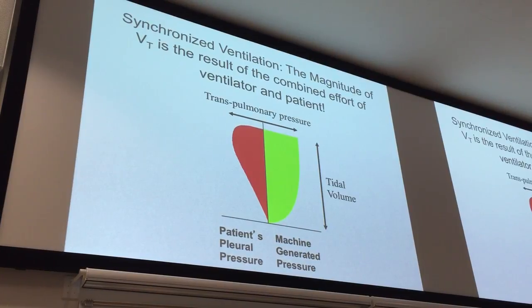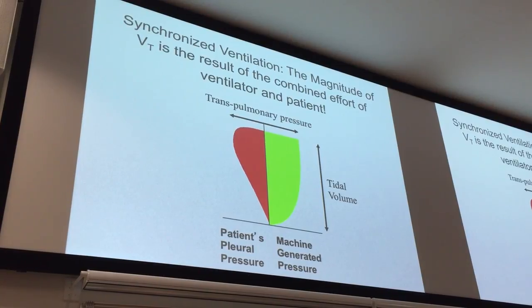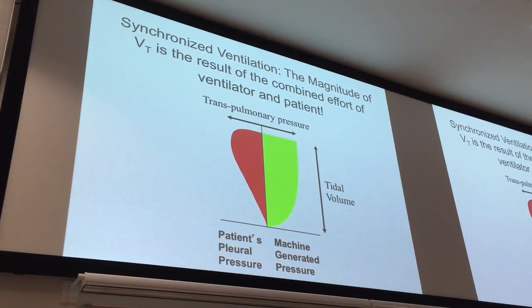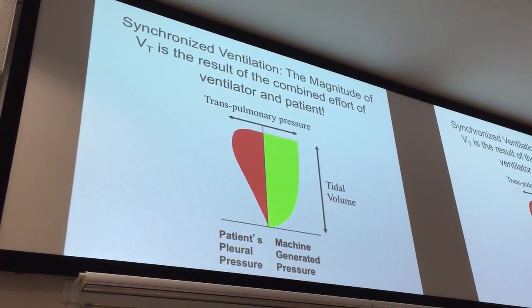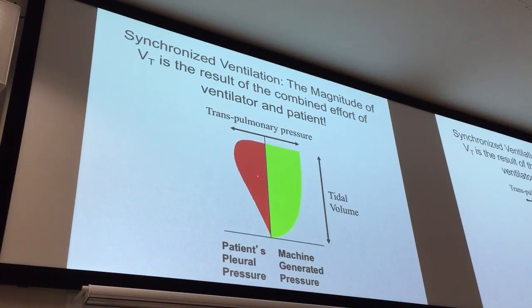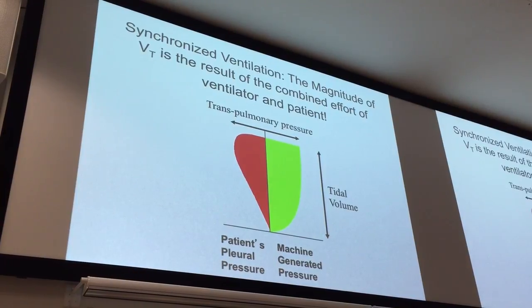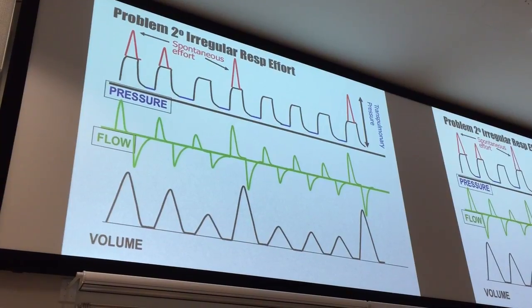So for those of you who like to look at your lung mechanics on the ventilator, if your baby's breathing actively, those numbers are fictitious. They're humbug, because we're not measuring the whole transpulmonary pressure. Graphics are extremely important for seeing whether your inspiratory time is adequate, expiratory time is adequate, all of that stuff. Please don't think that I'm poo-pooing graphics, they're very important. But we're not getting the full picture because we're not measuring this. And since we allow our babies to be awake and breathing, this is a very important component of what in fact goes on. And so this is what it translates into.